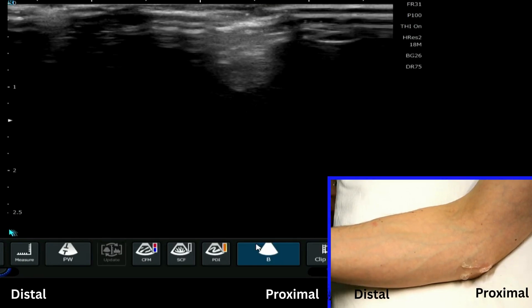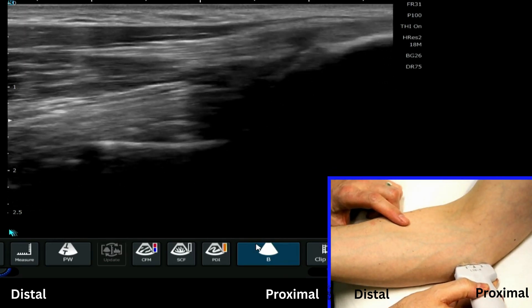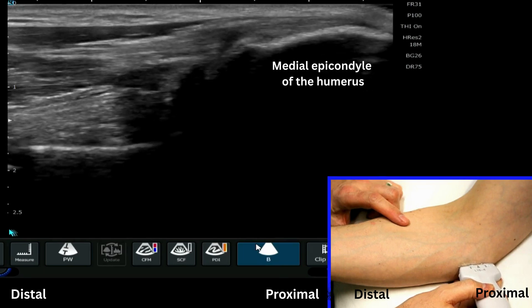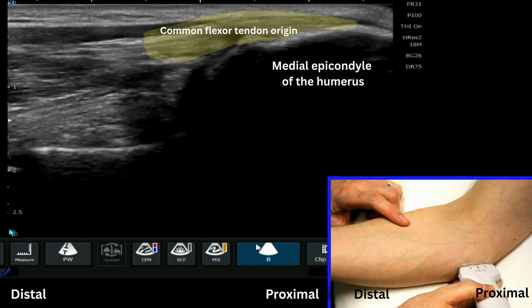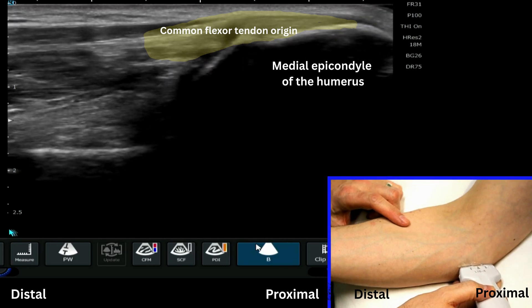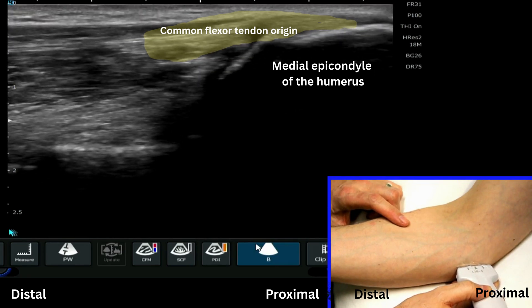For this video tutorial we're going to look at the medial aspects of the elbow and talk about some of the key structures in this area. One point to note is that we typically have to scan a little bit further around, more posterior than people might be expecting, so don't be surprised if you're having to work a little bit more posterior around the elbow.